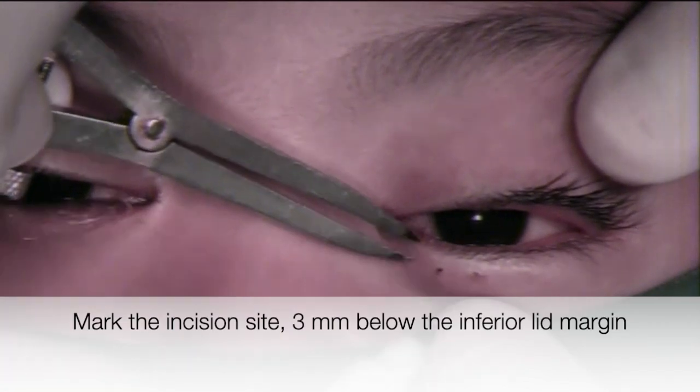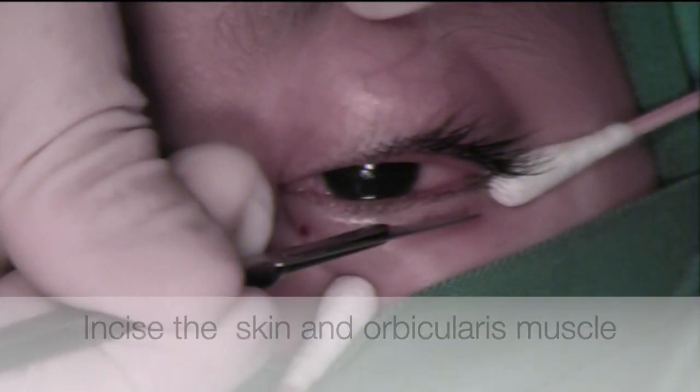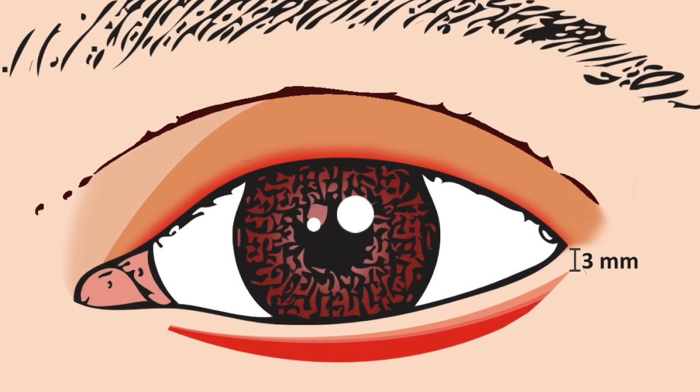First, mark the incision site 2–4 mm below the inferior lid margin. In this video, we use a 3 mm mark. Then, incise the skin and orbicularis muscle using blade number 15. Your incision should look elliptical, as shown in this illustration.